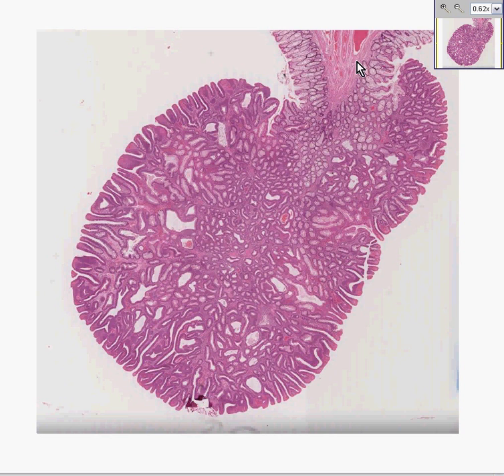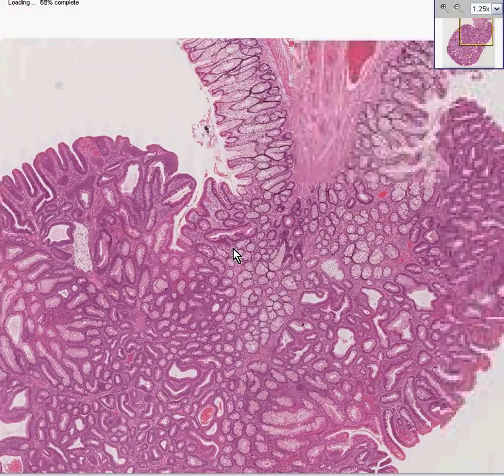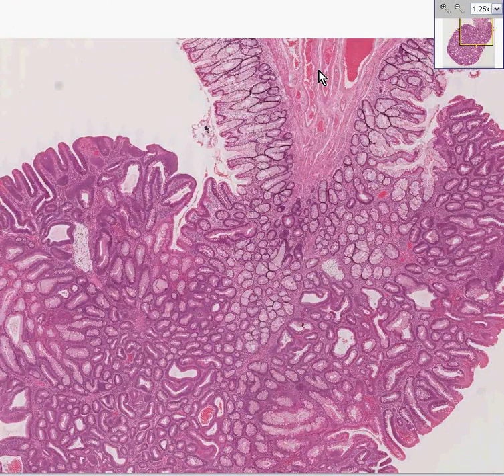Perhaps you could see some muscle of the muscularis mucosa, and you could certainly start to see some vessels of the submucosa as well. This is the type of polyp that's known as an adenomatous polyp. They are also called tubular adenomas almost interchangeably. These are the type that may, with time, sometimes turn into malignancies, and there's a lot of evidence for that.